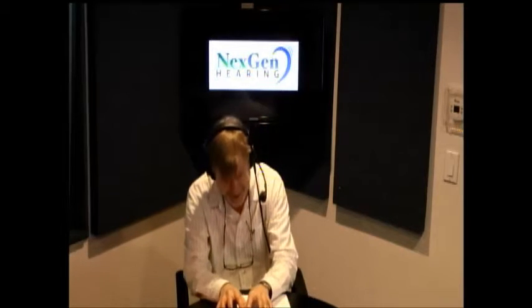And hearing aids today are digital. By the way, they're all programmed on a computer with software. And it might be hardwire connected, or it might even be via Bluetooth. And you are programming the hearing aids according to the prescription, which is based on the client's audiogram. Digital. What a wonderful world it has created in so many ways.